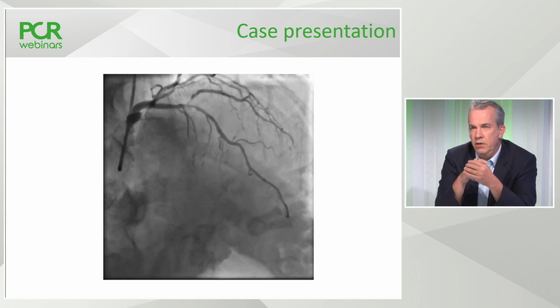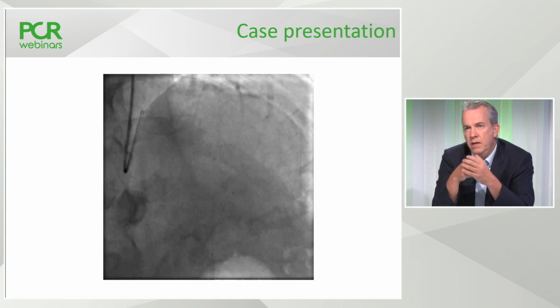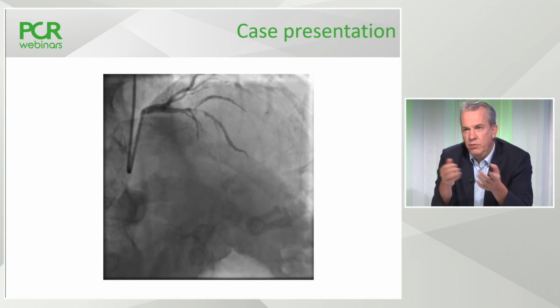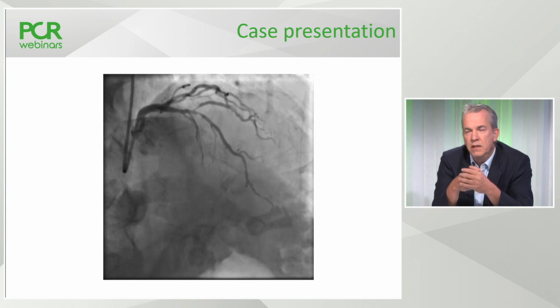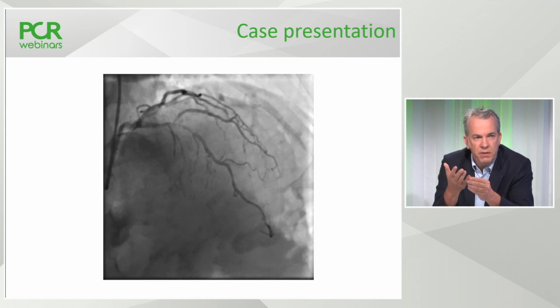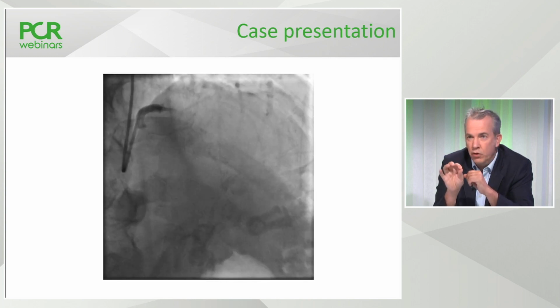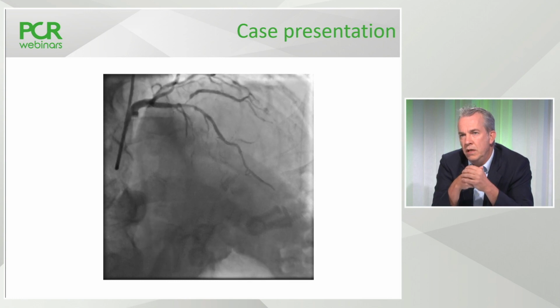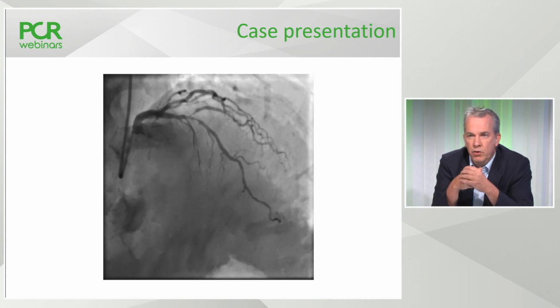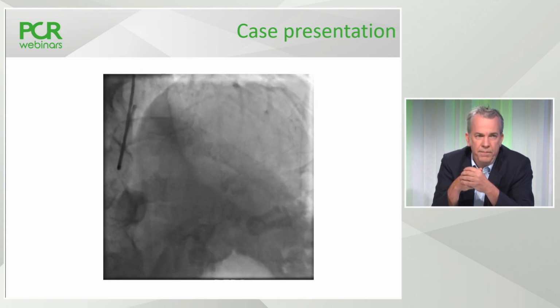So this kind of anatomy that you're seeing at the moment, you've got a side branch which is definitely 2.5 millimeters in diameter. There's certainly 10 millimeters of very tight disease at the ostium. That's a blood vessel which is capable of causing angina in its own right. You want to treat it. But as people watching will recognize, you don't see this anatomy very often. Normally, disease is much more constrained and confined to the very ostium of the side branch, and the need to put two stents does not need to be considered. In this anatomy, which you may come across a few times a year, a culotte is a very good option. Bernard, do you agree with that?